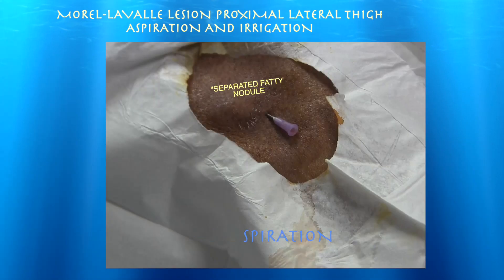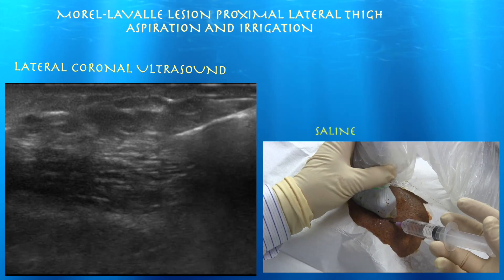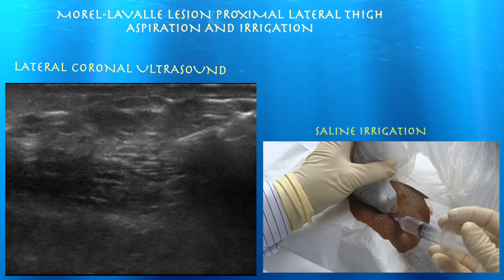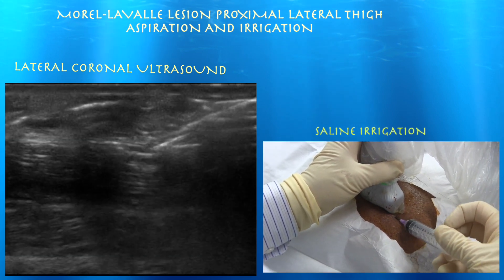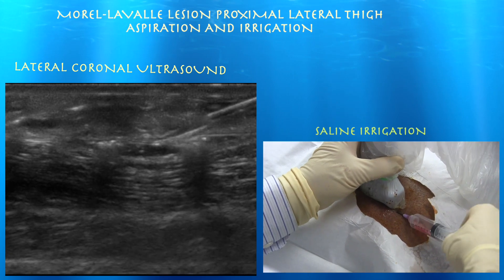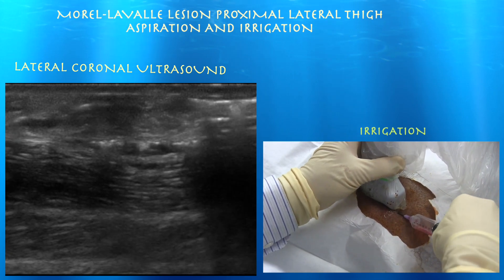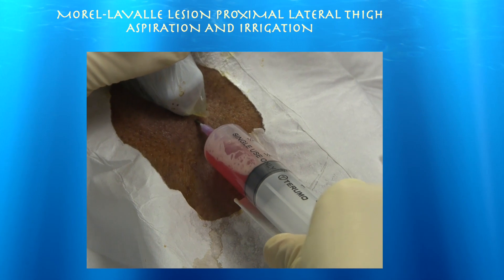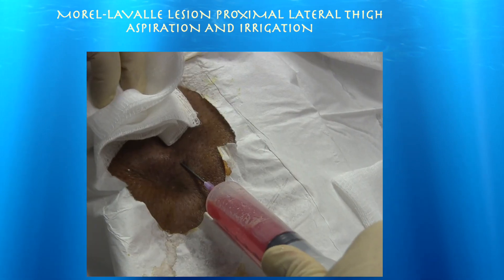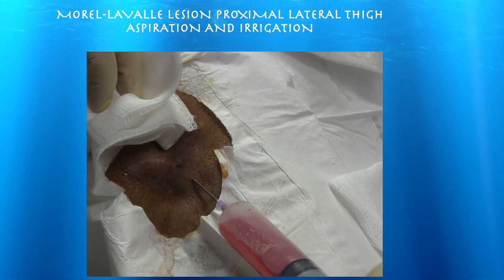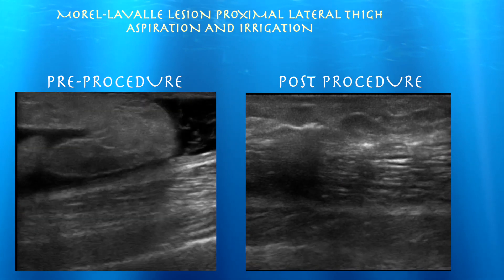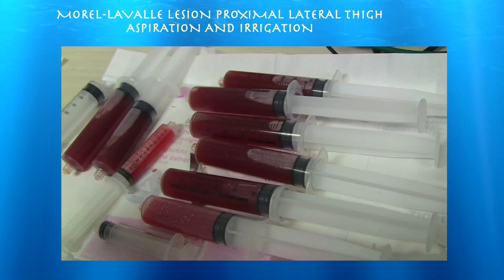What we were left with was just this separated fatty nodule. We initially tried to irrigate with some saline to remove any residual blood or debris, then withdrew whatever we had infused. Comparing pre-procedure versus post-procedure, we essentially eliminated almost all the fluid.